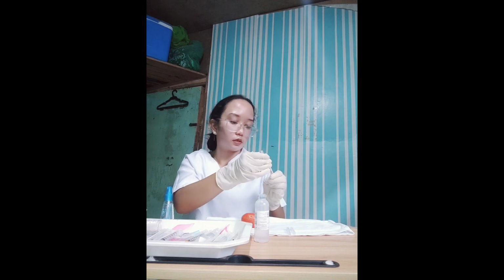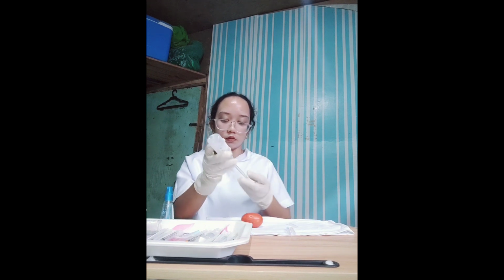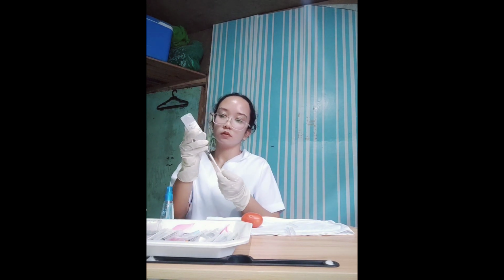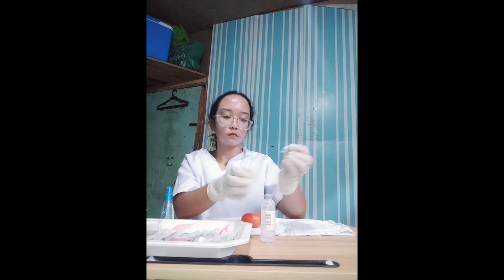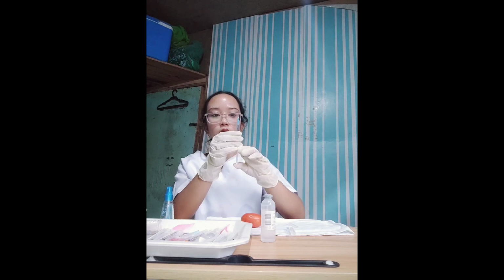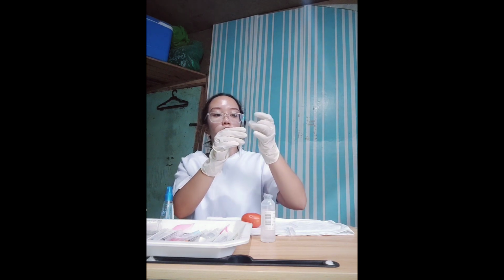And we will expel any air bubbles, so a small amount of air will not harm the tissues.